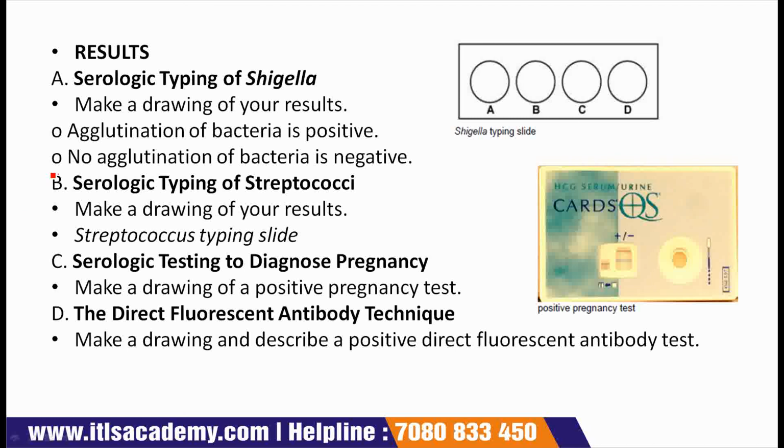For the results of serologic typing of streptococci, make a drawing of your results. Streptococcus typing slide. For the results of serologic testing to diagnose pregnancy, make a drawing of a positive pregnancy test. You can see this is positive pregnancy test.